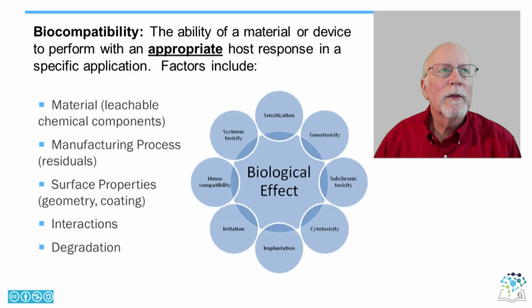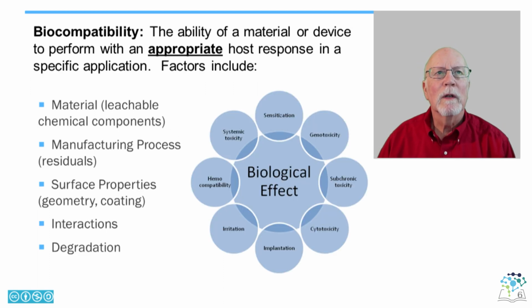Biocompatibility is a characteristic of a device or device component denoted by its compatibility with biological systems, as indicated by an appropriate or acceptable host response of the biological system to the deployed finished device.